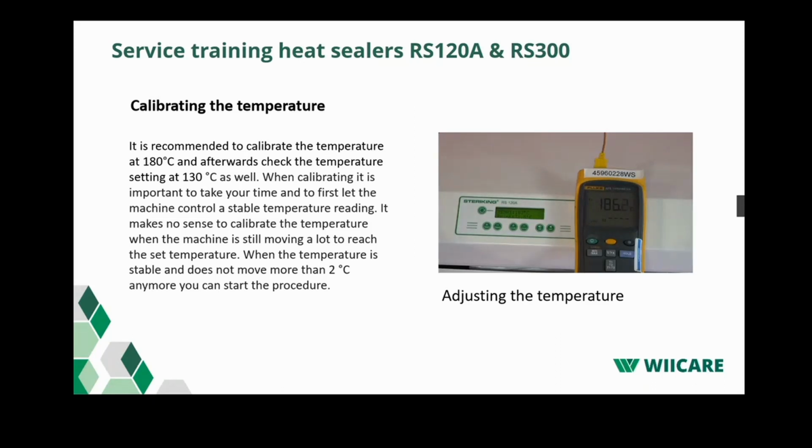If the sealer indicates a lower temperature, we have to adjust the print temperature upwards. We do this by pressing count plus. And this screen actually becomes visible when you put the test jumper on the PCB board. If you do not put the test jumper on the PCB board, you will not be able to get into this menu.